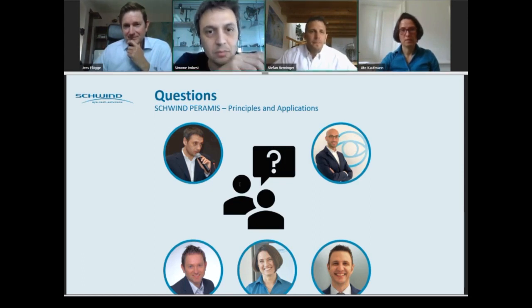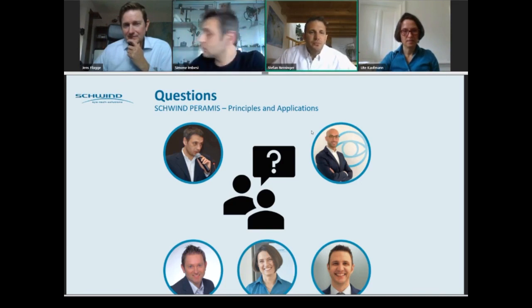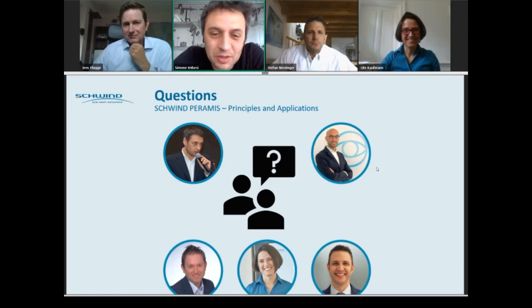Okay, wonderful. The next question is related to the head position. The tilting of the head will influence the fixation of both eyes. How does Peramis get rid of the additional deviation? The question was for Simone, but I think that I can answer this. One eye is not measured, so the measurement of the topography is monocular, not binocular.